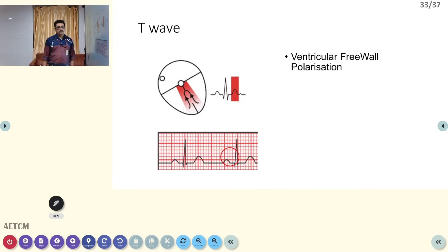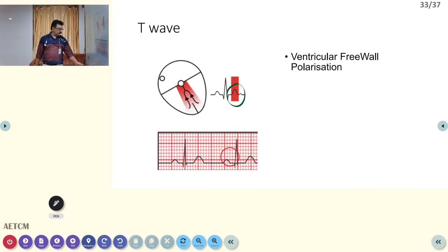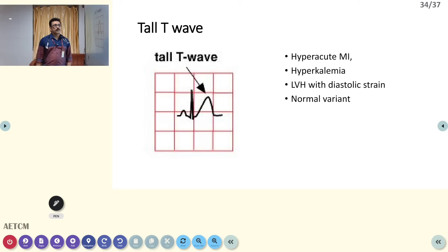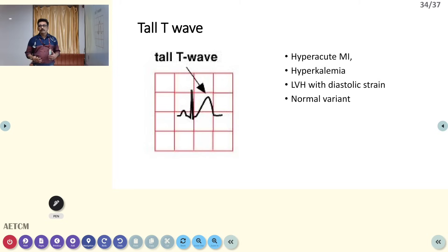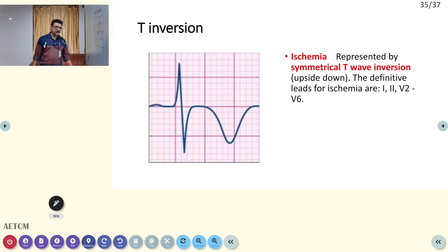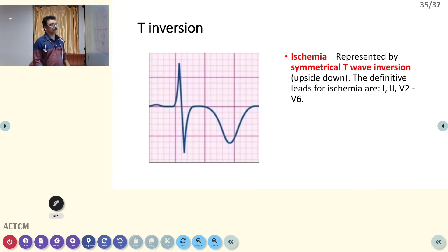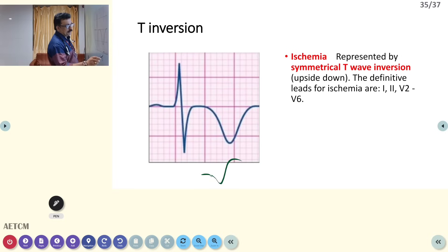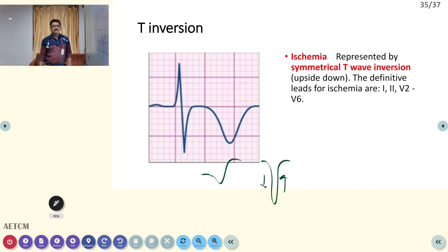T waves are normally upright. Very tall T waves can indicate hyperacute MI or hyperkalemia — if tall T waves are seen in all leads it is likely hyperkalemia; if only in a few leads, it suggests hyperacute myocardial infarction. LVH with diastolic strain can also produce large T waves. Deeply inverted, symmetrical T wave inversion — where both limbs of the T wave are equal — always indicates ischemic heart disease.